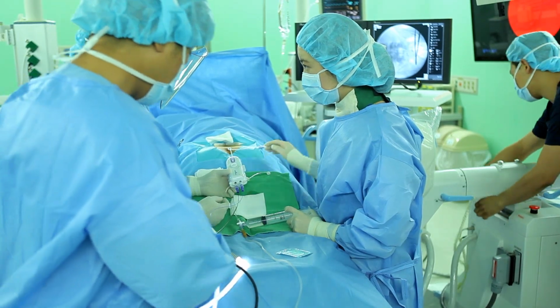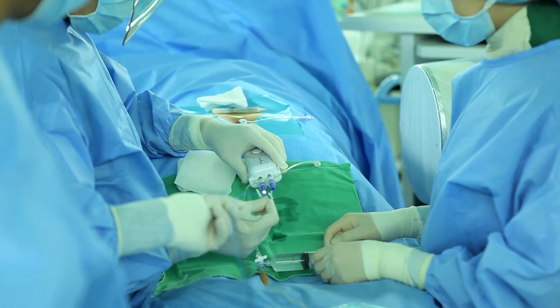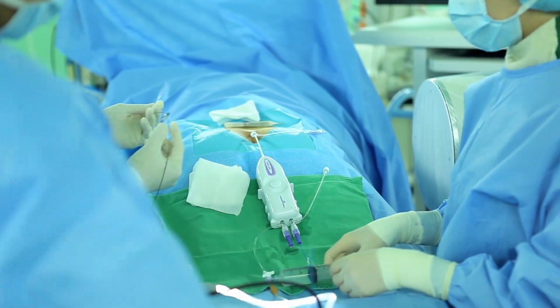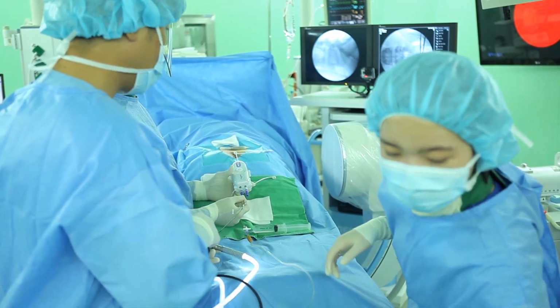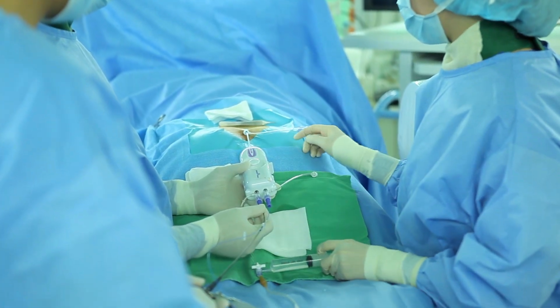You take out the endoscopic cable. Then, clear the cable tip with the wet gauze or check any substance on the connection part of the endoscopic cable. The purpose of the saline injection is to secure the way for the catheter advancement and to have a clear vision around the endoscopic cable.